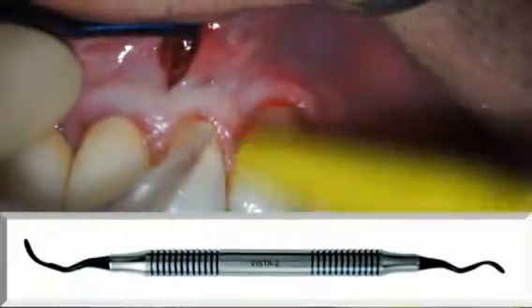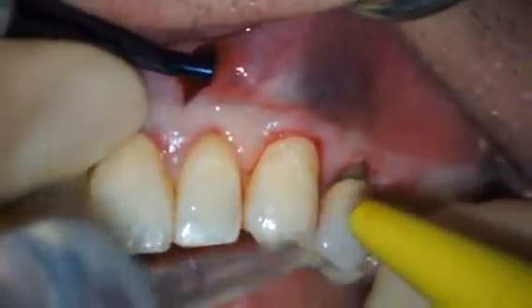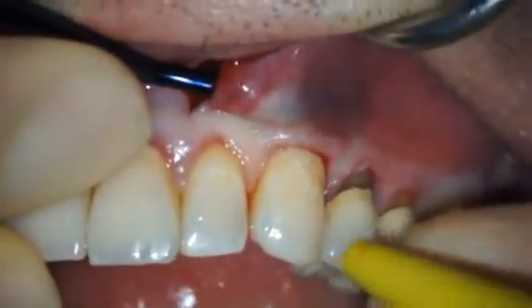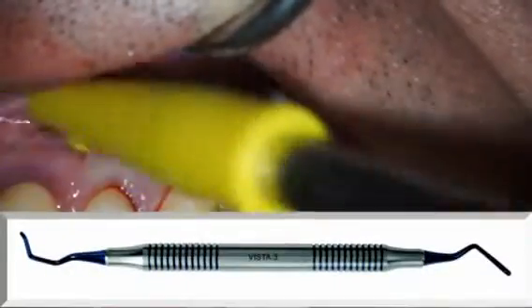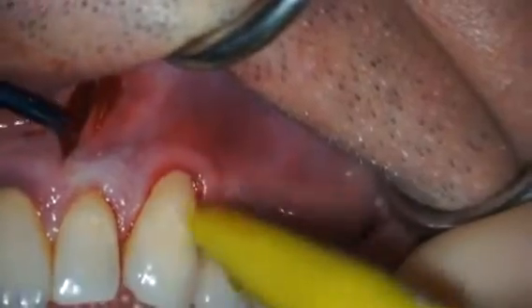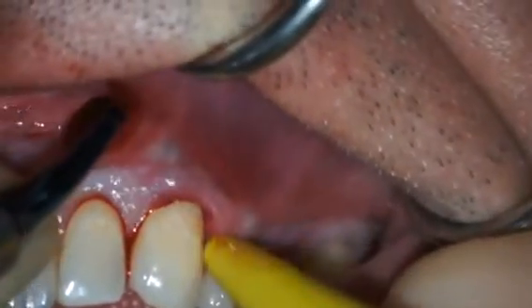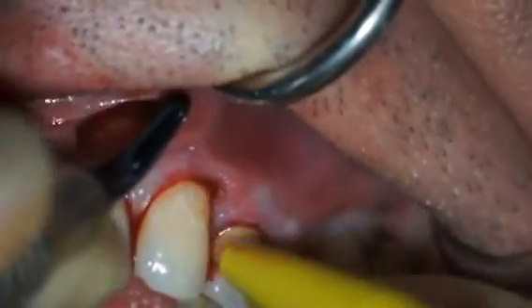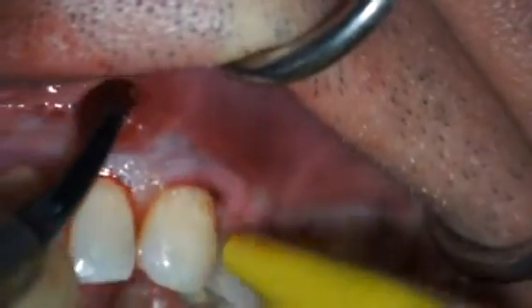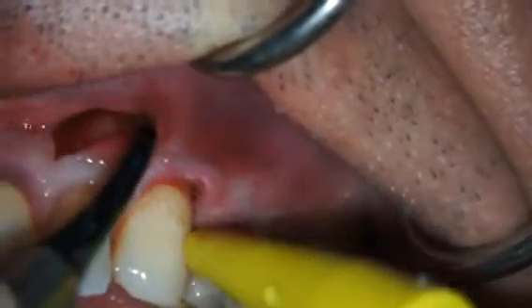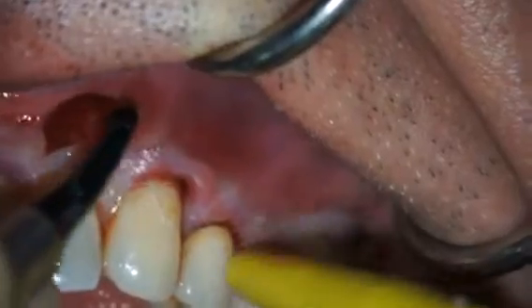A VISTA 2 periosteal elevator with a curved shank is then used to extend the tunnel further distally, beyond the mucogingival margin. Using the shorter VISTA 3 and longer VISTA 4 elevators with bayonet curves, the tunnel is elevated through the gingival sulci of the treated teeth to facilitate low-tension coronal advancement. VISTA 3 is used to elevate the marginal tissues closest to the access opening, and VISTA 4 for elevation of the more distal sites. The tunnel is extended interproximately under each papilla as far as the embrasure space will permit, without perforating through the papilla.